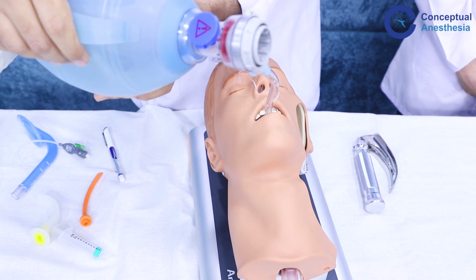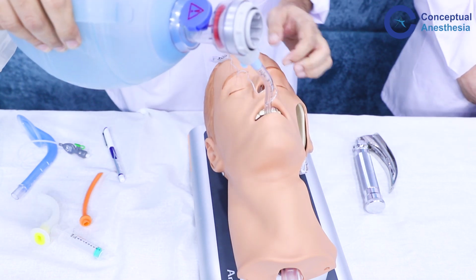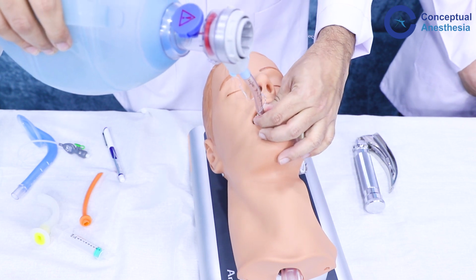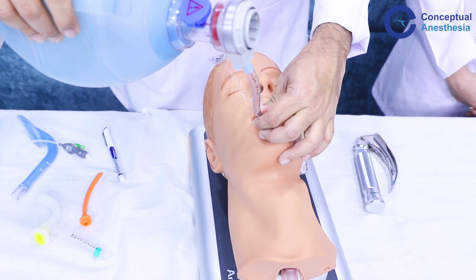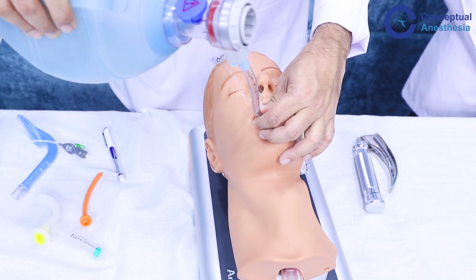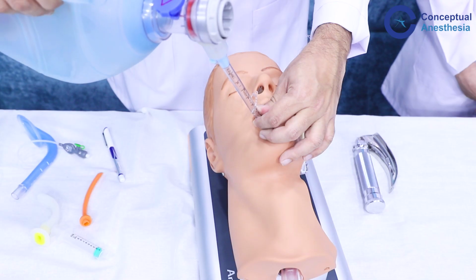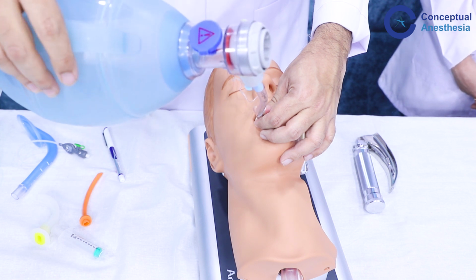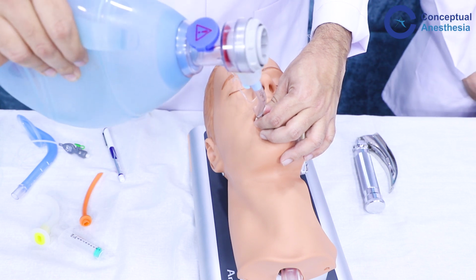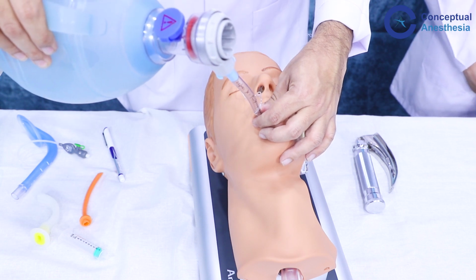Once you check the inflation of the lungs and you auscultate for air entry to be bilaterally equal, and you can see capnograph on the monitor, that is when we confirm our endotracheal intubation. Make sure that you see at least 6 capnographs and they should be ideal, that is between 35 to 45 mm of Hg, so that you can confirm that this is your ideal endotracheal intubation. So this is the procedure of endotracheal intubation.